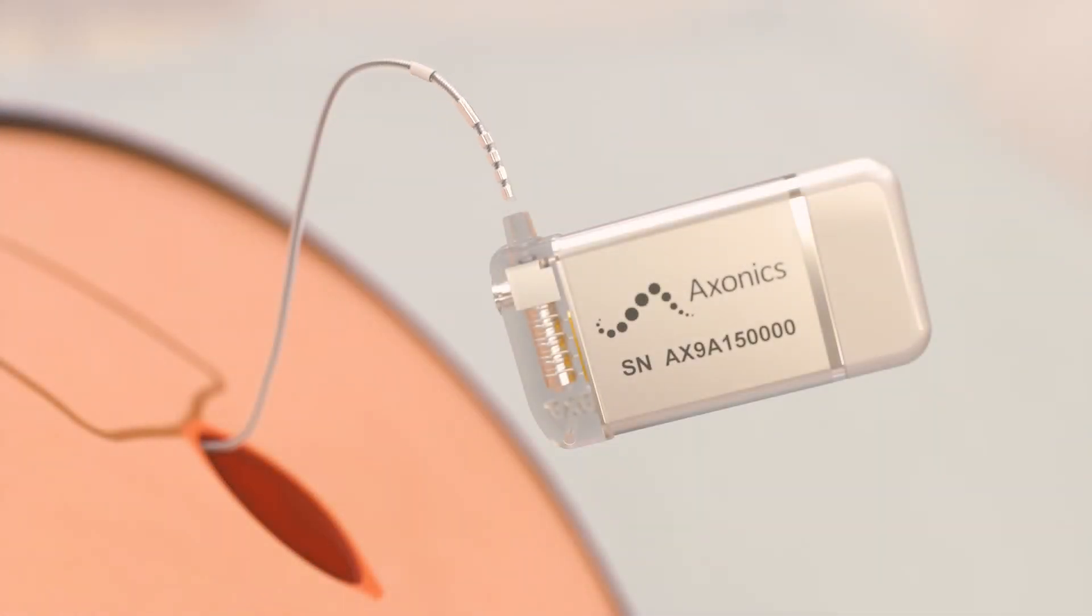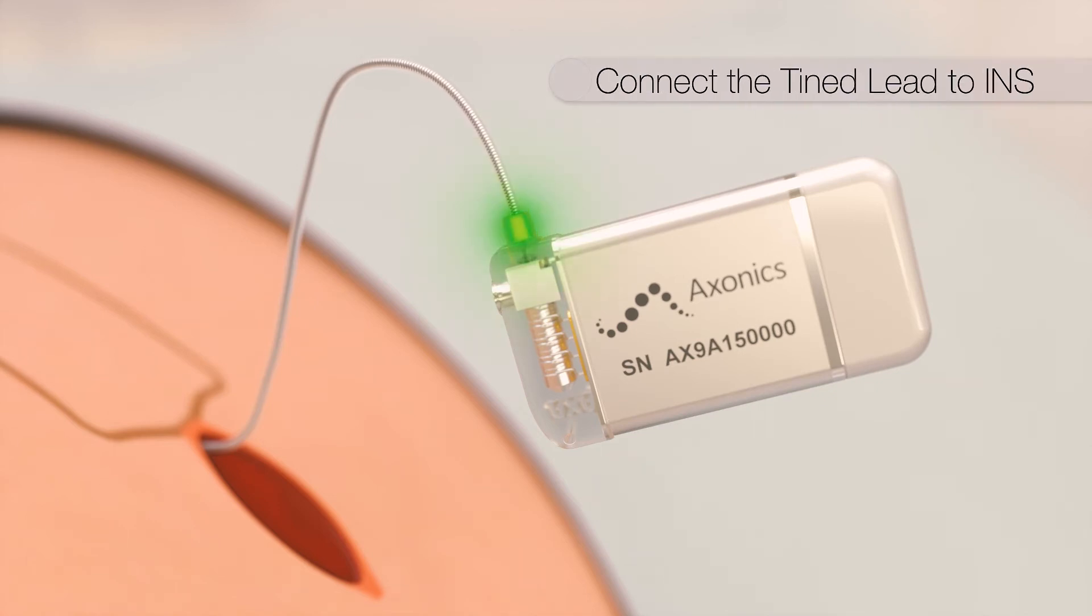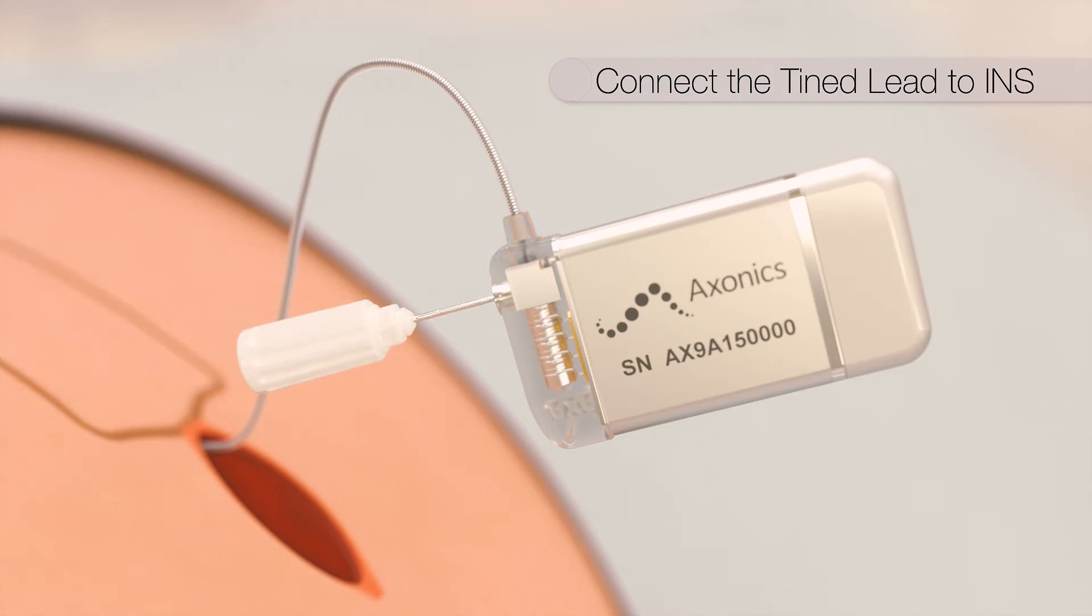The lead is connected to the stimulator ensuring the white indicator is inside the clear portion of the header. The lead is secured using the torque wrench to tighten the set screw until a click is heard.